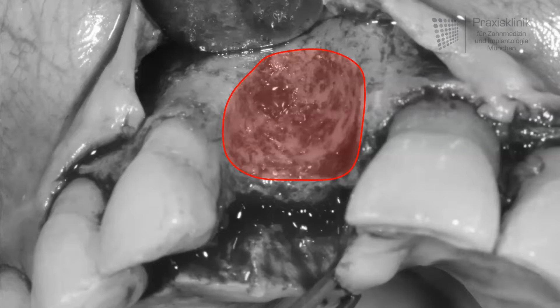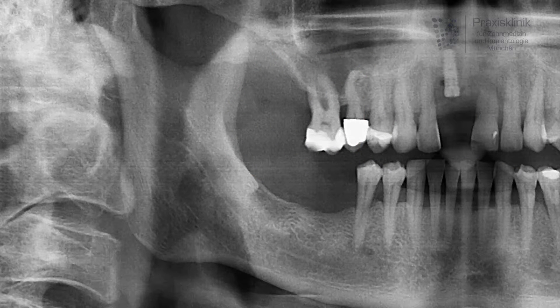Now we have to restore this defect and ideally we use for this procedure the patient's own bone. So the question is where to harvest this bone. Here marked with a red rectangle we see the donor site — an area at the posterior region of the lower jaw where we can harvest enough bone in very good quality to replace the missing bone at the bony defect in the upper jaw.